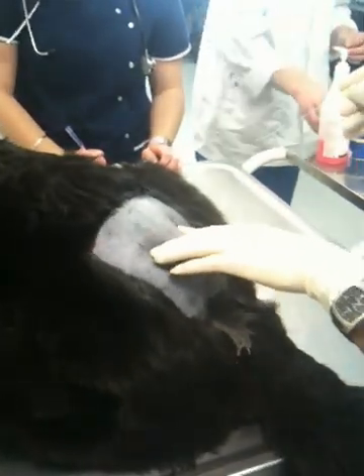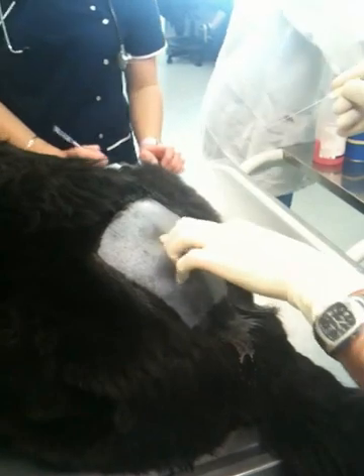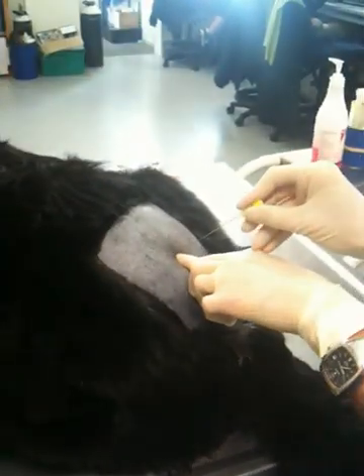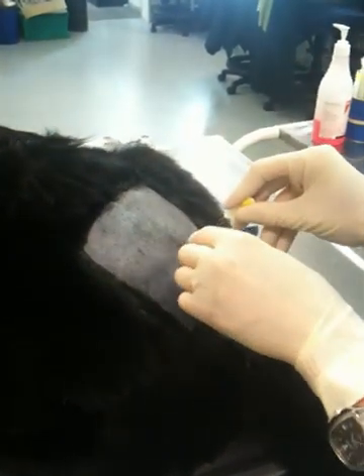Feeling for the wings of the ileum, just feel L7 there, there's S1 there. Go in between, 90 degrees to the stem.